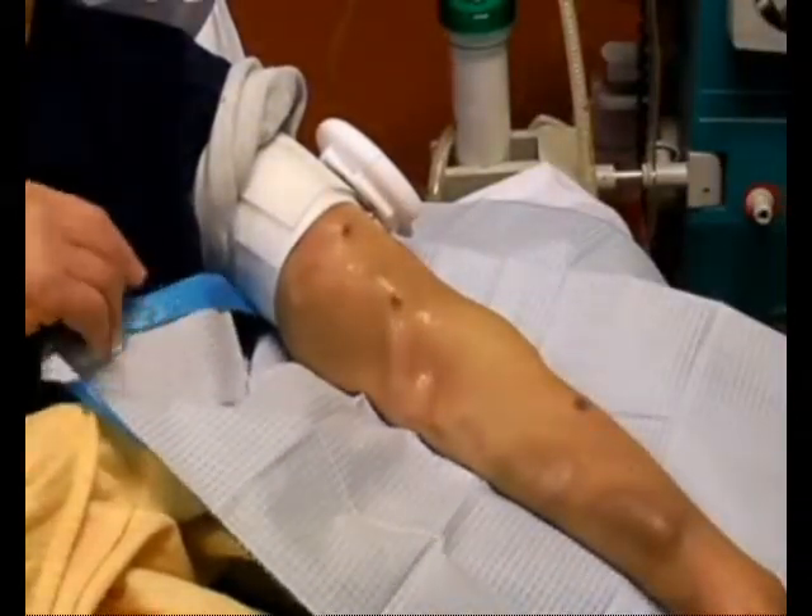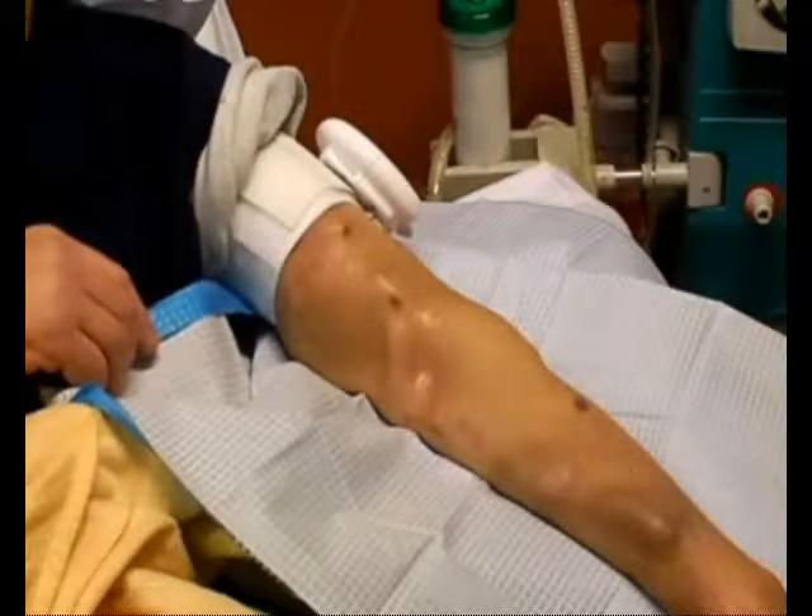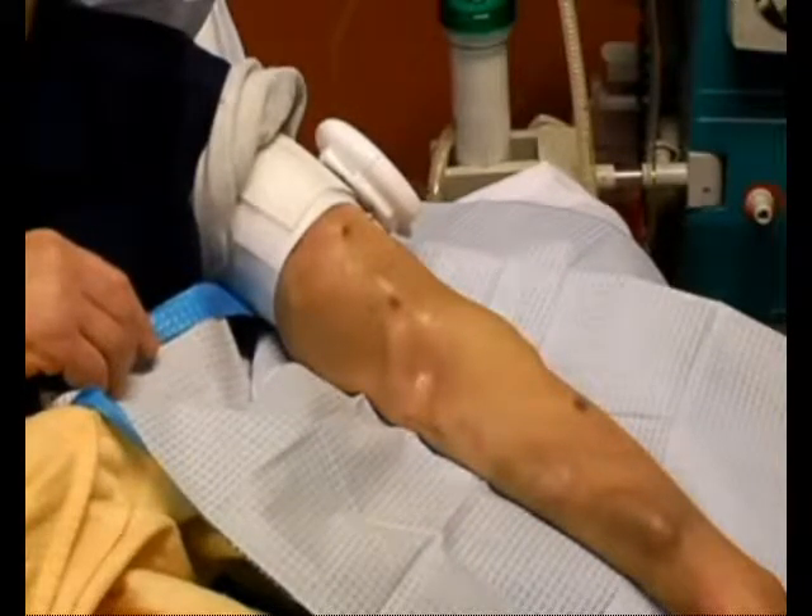Completely clean the area around the needle so that any fluid, blood, residual cleaning fluid, lotion, etc. is fully removed.